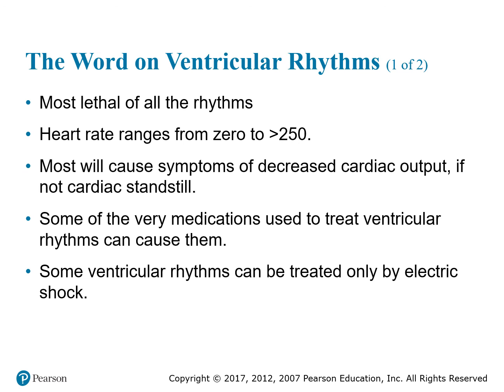Now, a word on ventricular rhythms. Ventricular rhythms, the most lethal of all rhythms, command great respect from healthcare professionals. They can result from escape or irritability, and can have a heart rate varying from 0 to more than 250 beats per minute. Although some ventricular rhythms can be well tolerated, many will cause symptoms of decreased cardiac output or, even worse, cardiac standstill. Some ventricular rhythms have no QRS at all. Others have wide, bizarre QRS complexes.